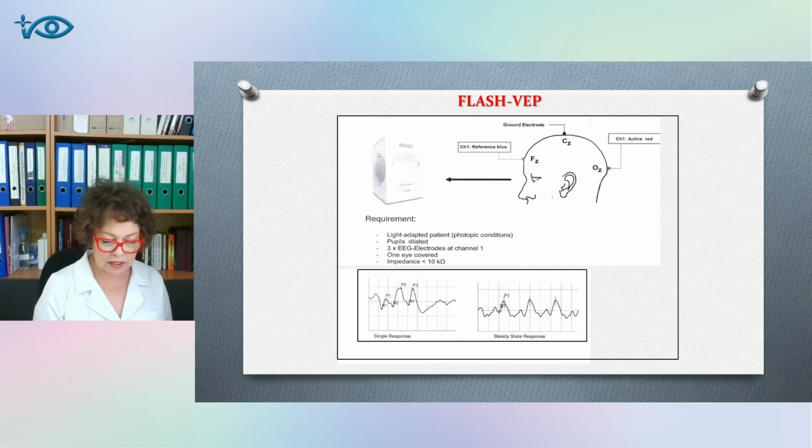The rate of excitation conduction is directly dependent on the degree of myelination of the nerve fiber, the state of synapses and the mediator systems. The amplitude of the peaks depends on the number of unchanged neurons and the state of the axons in the pathways. Later, we will consider clinical examples with the assessment of bioelectrical functional activity of visual analyzer in various pathologies, in parallel with other research methods.